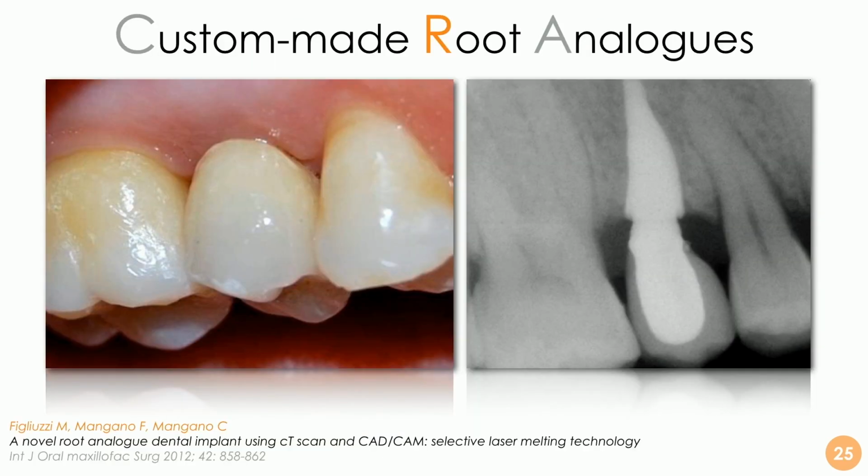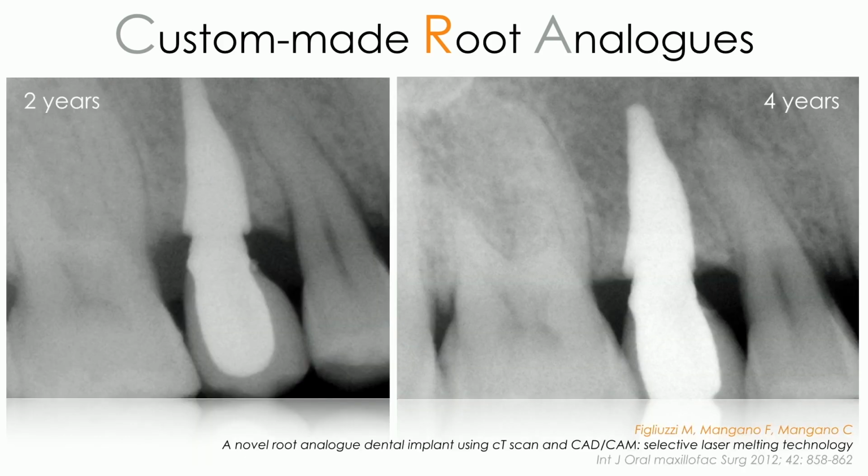And after one year, we can see the definitive restoration in place, and the picture is really fancy. I mean, it's something really fascinating if you watch, because we are used to seeing standard implants. This is a custom-made implant made exactly for the purposes of that patient, for that socket, to replace that root.